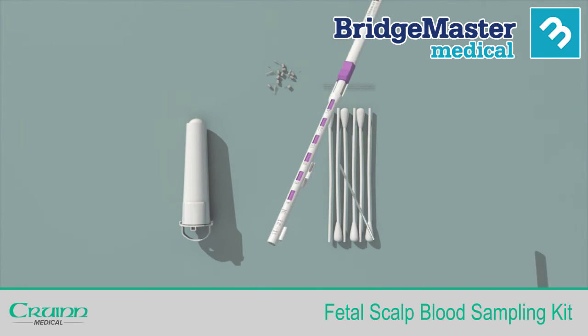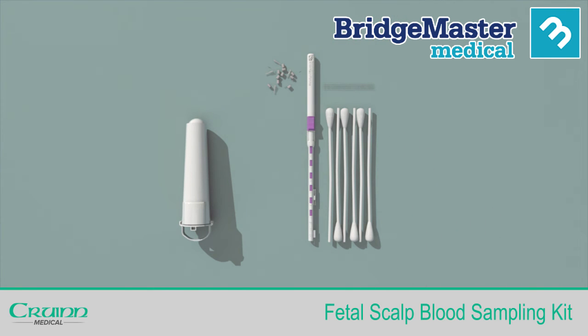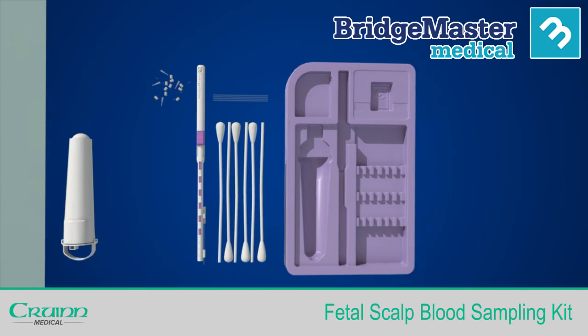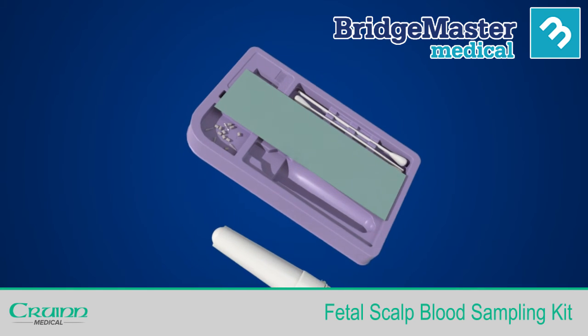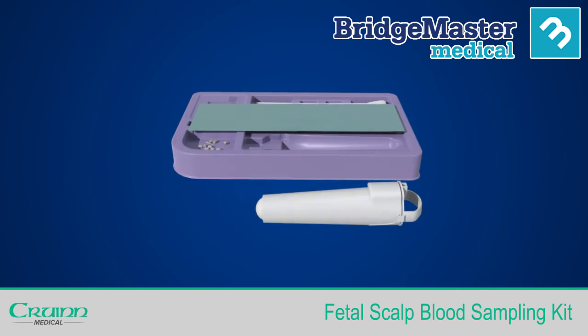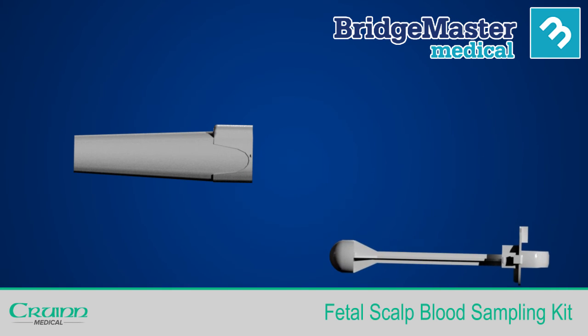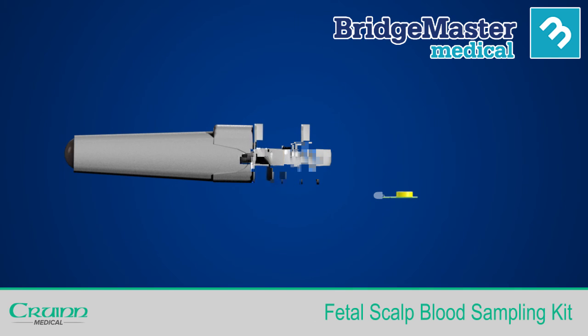The FSBS kit is designed to allow the collection of multiple samples. Simply follow the same instructions as before, using a new capillary tube to collect another sample. When you have completed the FSBS procedure, the entire kit, including the tray and ELA, can be disposed of in accordance with hospital protocol. ELA has been designed so that its circuit board and battery can be separated from the plastic parts and disposed of in your designated collection bins for each type of waste.